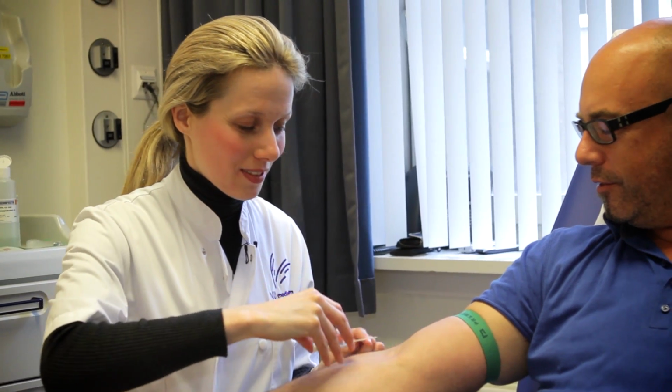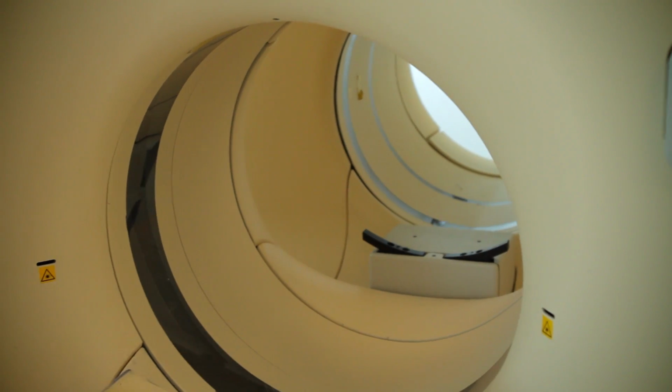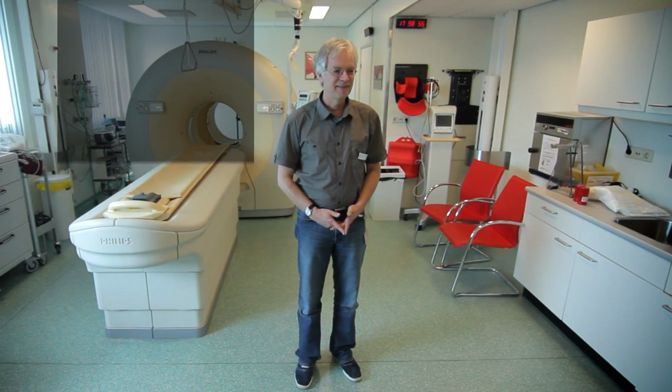With the introduction of hybrid scanners, radiology and nuclear medicine come together. Before we had this PET-CT scanner, we could only scan the PET image. So it was kind of tricky for us as nuclear medicine physicians, because we had the CT scan on one hand and we had the PET scan over there, and at times it could be quite difficult. You had to fuse them in your mind, so to say. You couldn't directly overlay them. That was quite difficult.